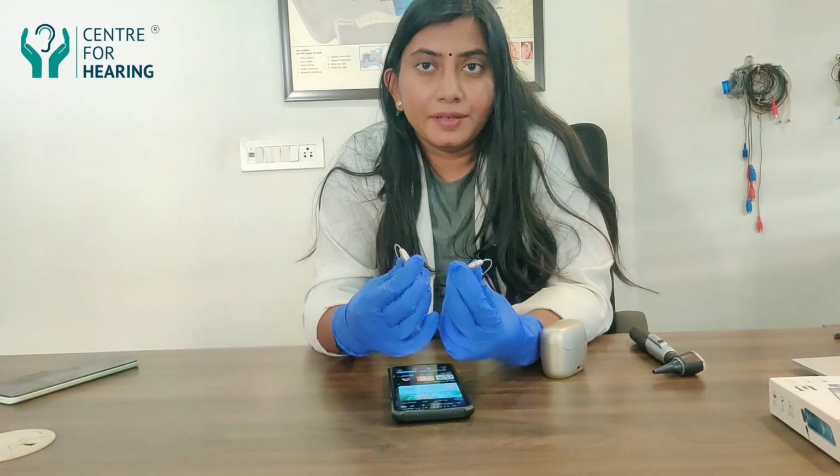Pairing is very simple. You just need to restart the device and then pair. It will detect. That's it. So this you can use for checking your battery and doing minor adjustments.